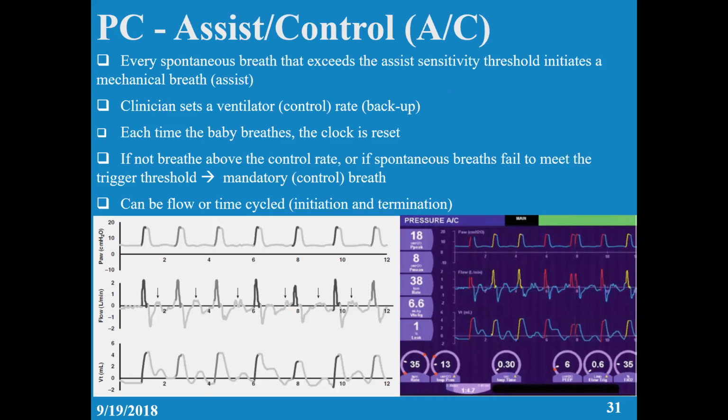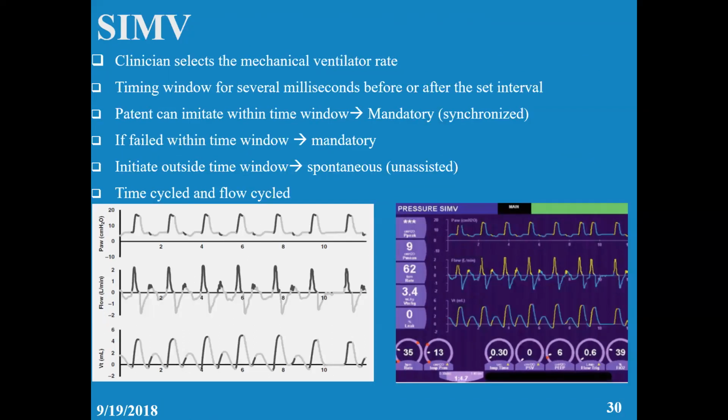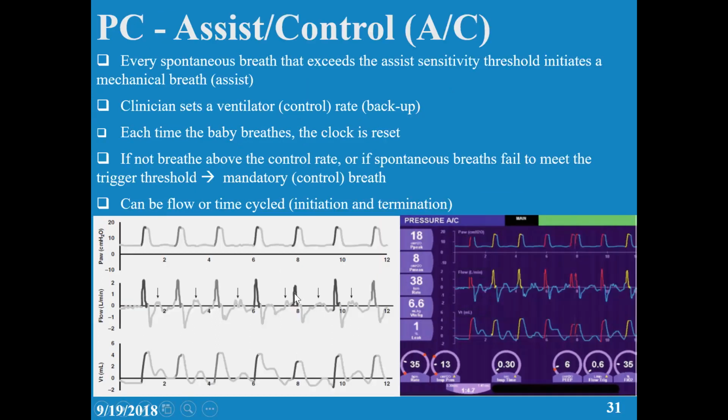So it's always synchronized with the patient. In mandatory, of course, you will see the spontaneous and you will see the mandatory. You will never see assisted. You can see it's all one color. Now you look at here, you can see some are supported and some not supported.